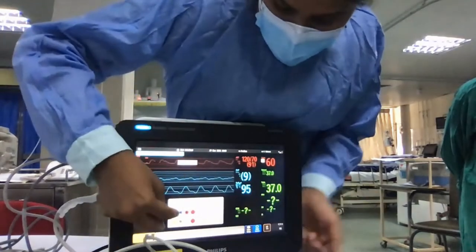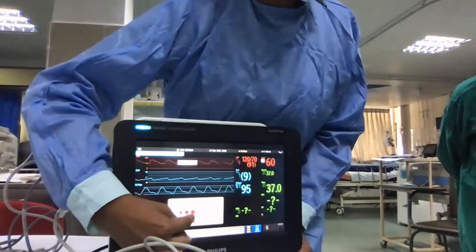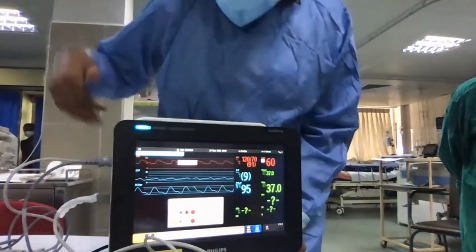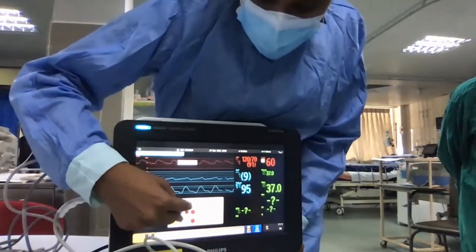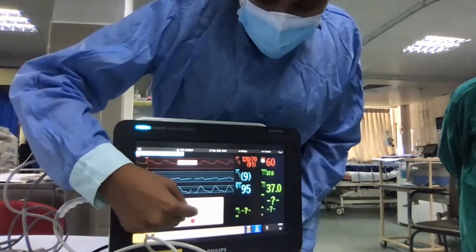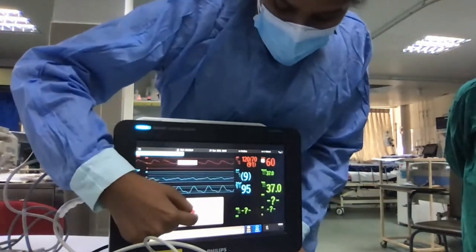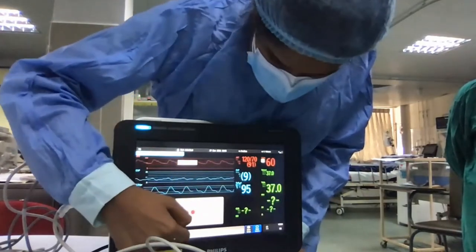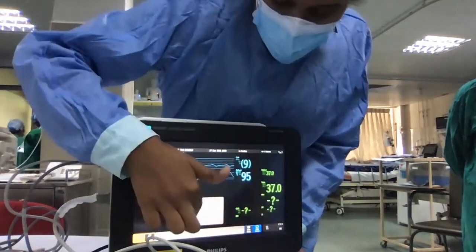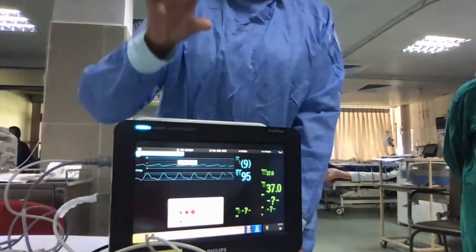So here, this is the port. This is the extension where I have given arterial. So it is already marked as ART. No problem. Then the other one is also marked as CVP. So no confusion here. We have already marked the correct label. Say in case this port is deactivated, when you click on this icon, what you will see is grayed out ports like this.